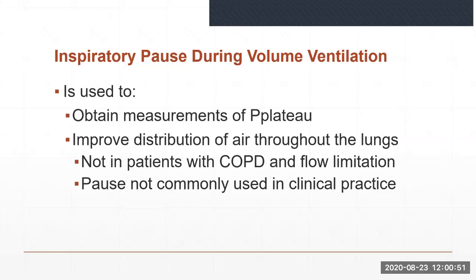The inspiratory pause or inflation hold, also called end inspiratory pause, is a maneuver that can be performed by preventing the expiratory valve from opening for a short time at the end of inspiration when the inspiratory valve is also closed. Most ICU ventilators have an inspiratory pause button or control. The inspiratory pause maneuver is used to obtain measurements of plateau pressure, which allows estimation of the alveolar pressure for the calculation of static compliance.